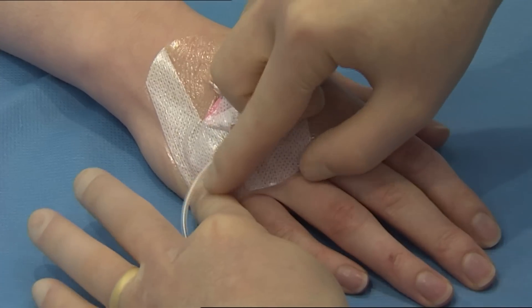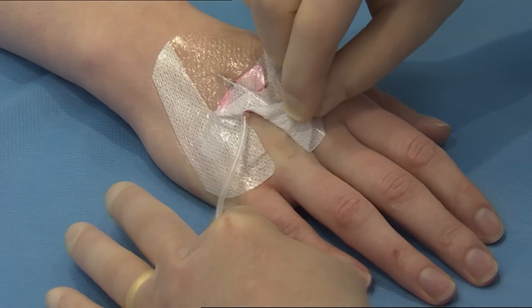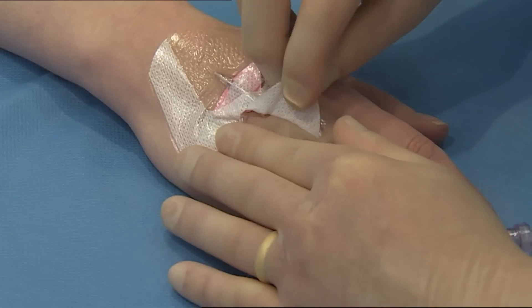Separate the soft cloth section from underneath the extension tube and peel back the soft cloth towards the insertion site using a low and slow technique.